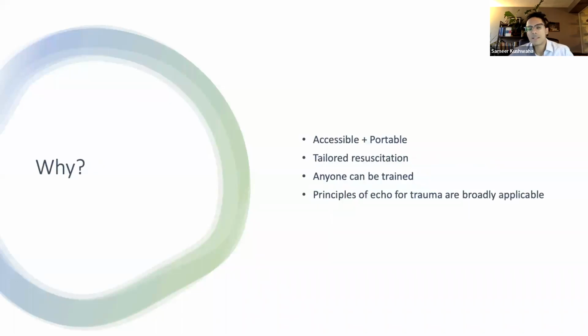So first, why is this a relevant topic, and why is echo used in trauma situations? Well, echo is a very accessible diagnostic tool that's becoming increasingly accessible with the use of smaller devices that can attach to phones and other devices. And it can be used very quickly on an unstable patient. It can be used to rapidly investigate the cause of shock and modify management at the bedside. And pretty much any clinician can be trained in undertaking a basic assessment with echo.